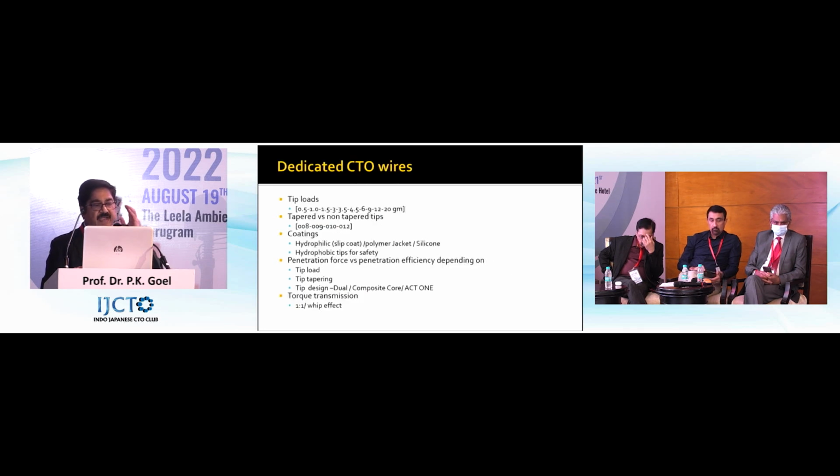The CTO wires you have to understand in terms of tip loads, tapered versus non-tapered. Most of them are tapered. Different wires have different taperings. Coatings, hydrophilic and non-hydrophilic. Several times, the Sion Blue has a hydrophobic tip 1 millimeter, because hydrophilic coatings make the feedback difficult. It just slides through. So you want the feedback from the lesion, that's important.